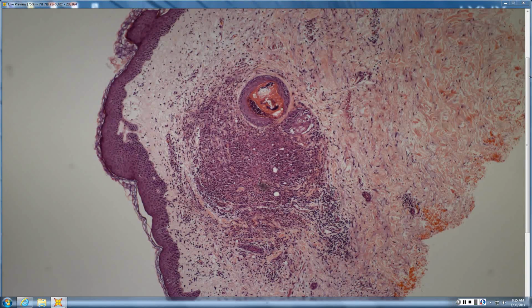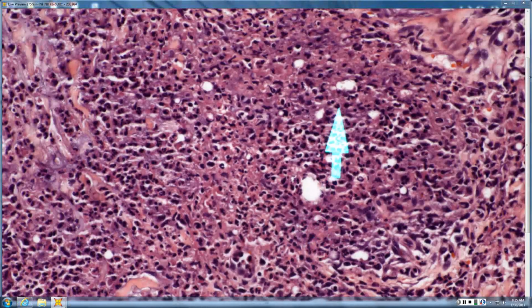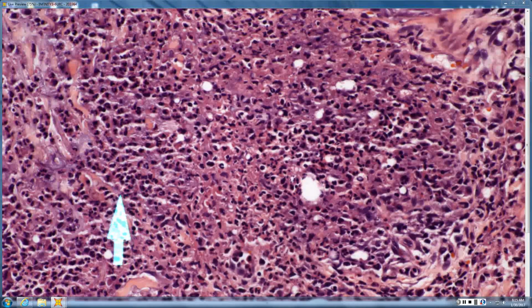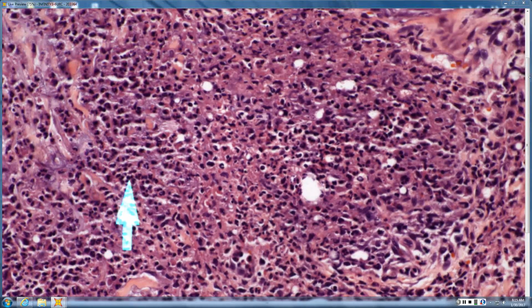Another pretty dense infiltrate. Maybe a few vacuoles, which means you'd always want to look in the vacuoles, right? Yes. In this case, I don't see much in the vacuoles. But there's certainly, what are all of these cells? Those look like ants with segmented bodies. Neutrophils.